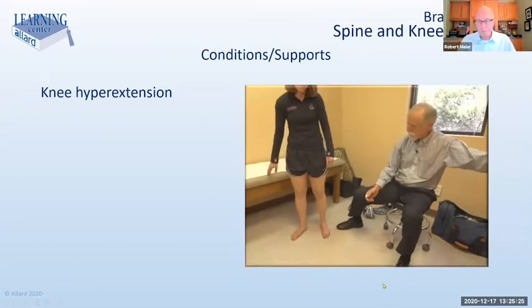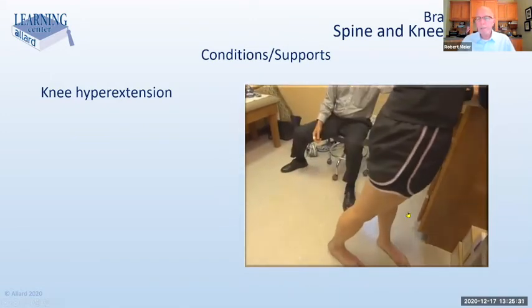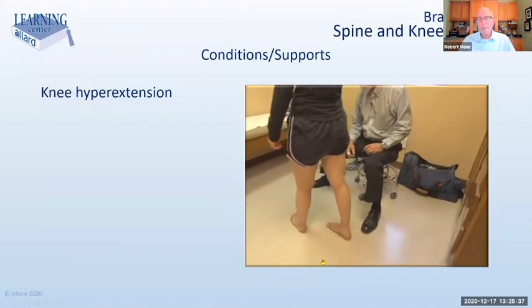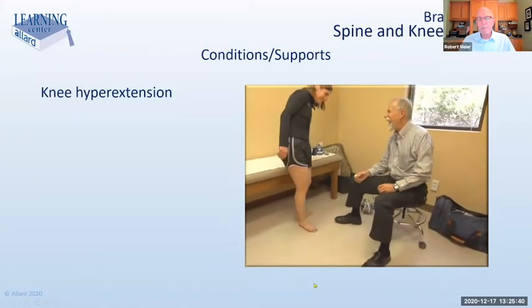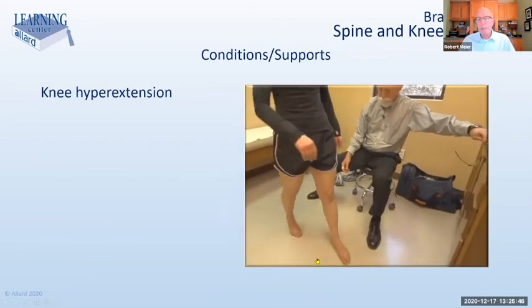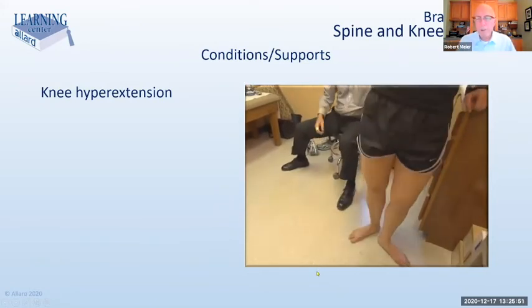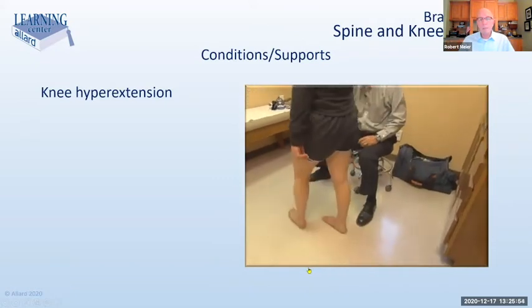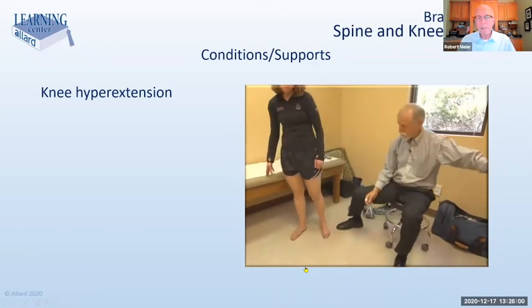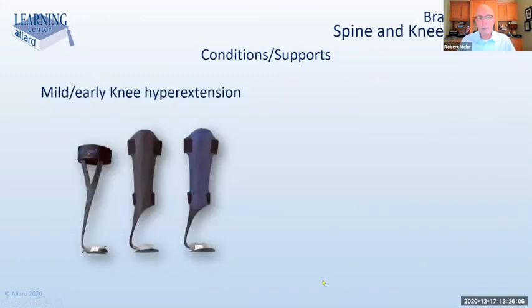So here's a young lady, and she's left side involved. You can see her foot drop there. You can see her knee just being driven into knee hyperextension because of her foot drop. You can't see it very well there. We'll replay this video. Watch it again. Watch this knee. And it's going to be driven into knee hyperextension because, oh, that almost hurts, ouch, because of that foot drop. So very, very common in any of the neuromuscular conditions that can lead to foot drop. It's very common to find associated knee hyperextension issues that need to be dealt with.